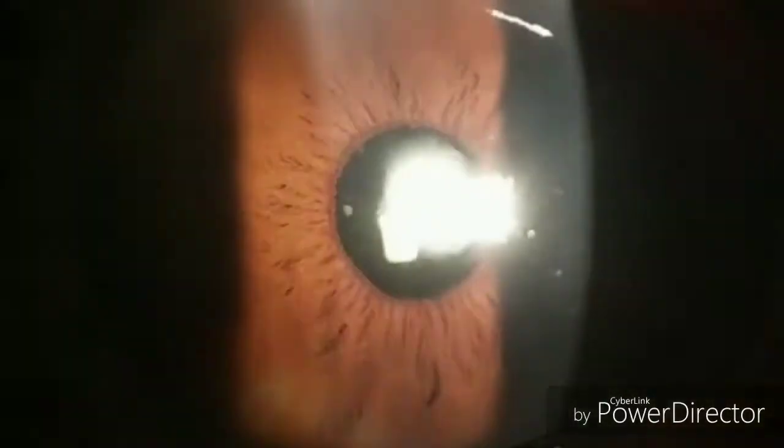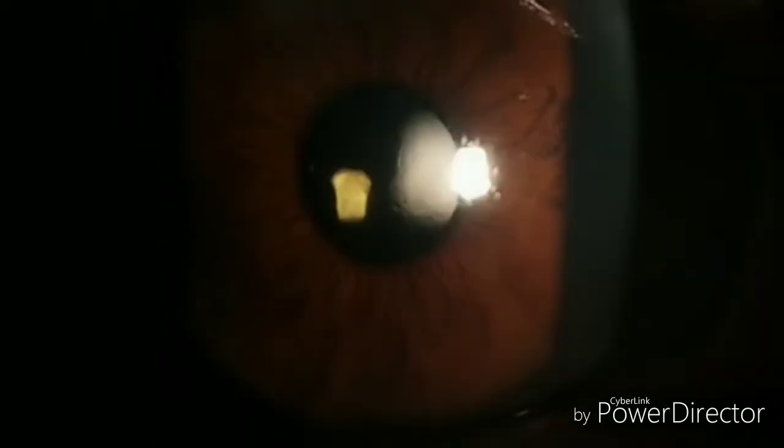Today's topic is about the lens of the eye — how the crystalline lens looks, how it looks when you remove the cataract and put an intraocular (IOL) artificial lens, and how it looks when you don't put an IOL.